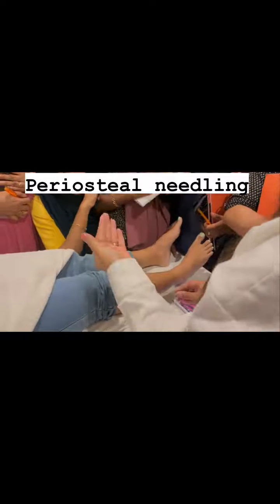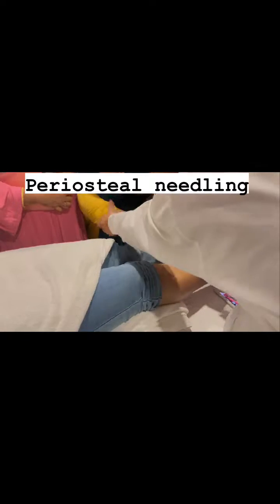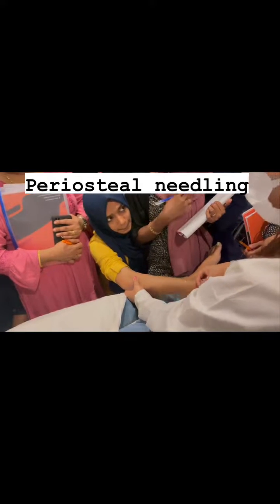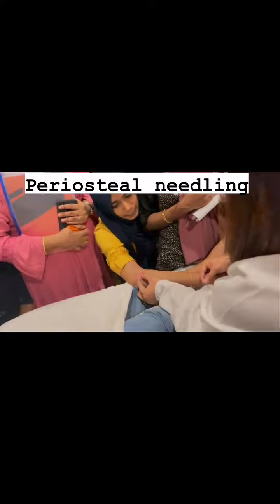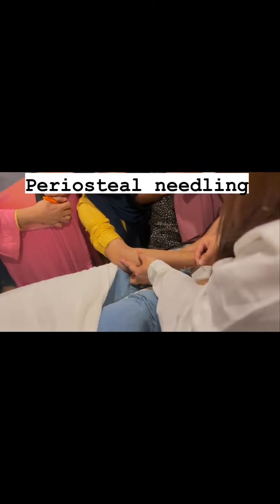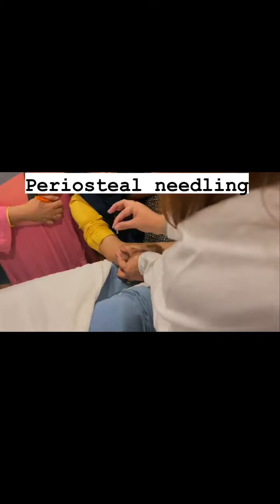Same way, if you want to do it on the lateral epicondyle — this is the lateral epicondyle — in cases of tennis elbow and all, you get so many cases. Typically on this bone, you will hook it like this, because the radial nerve is just beneath, just posterior to this. So you don't poke on that; you hook it and then proceed.